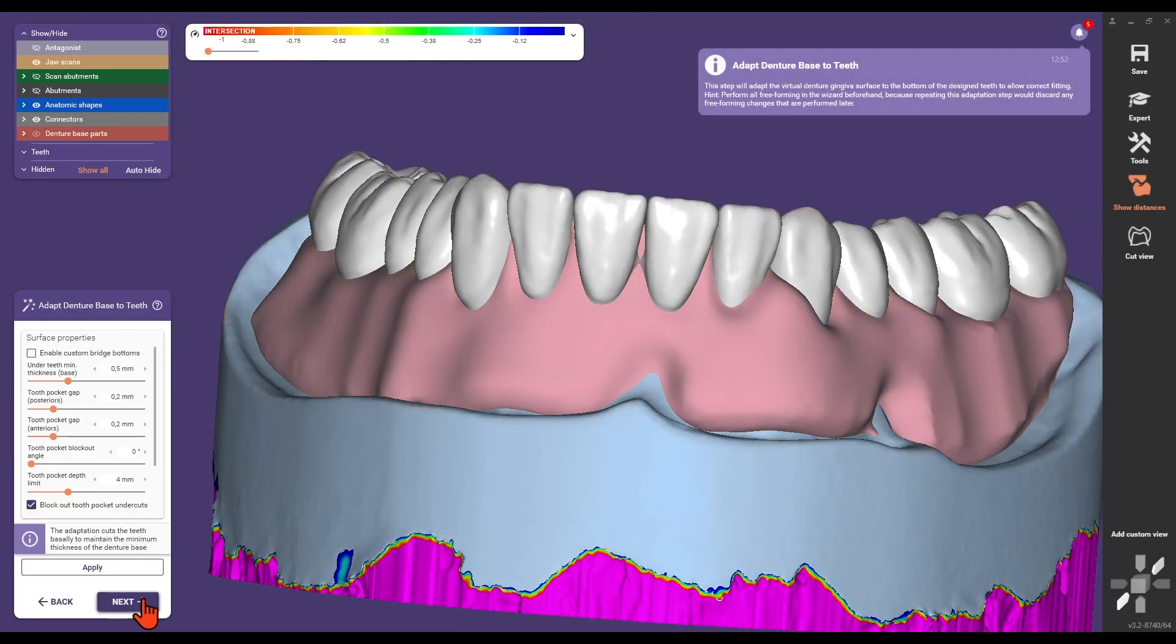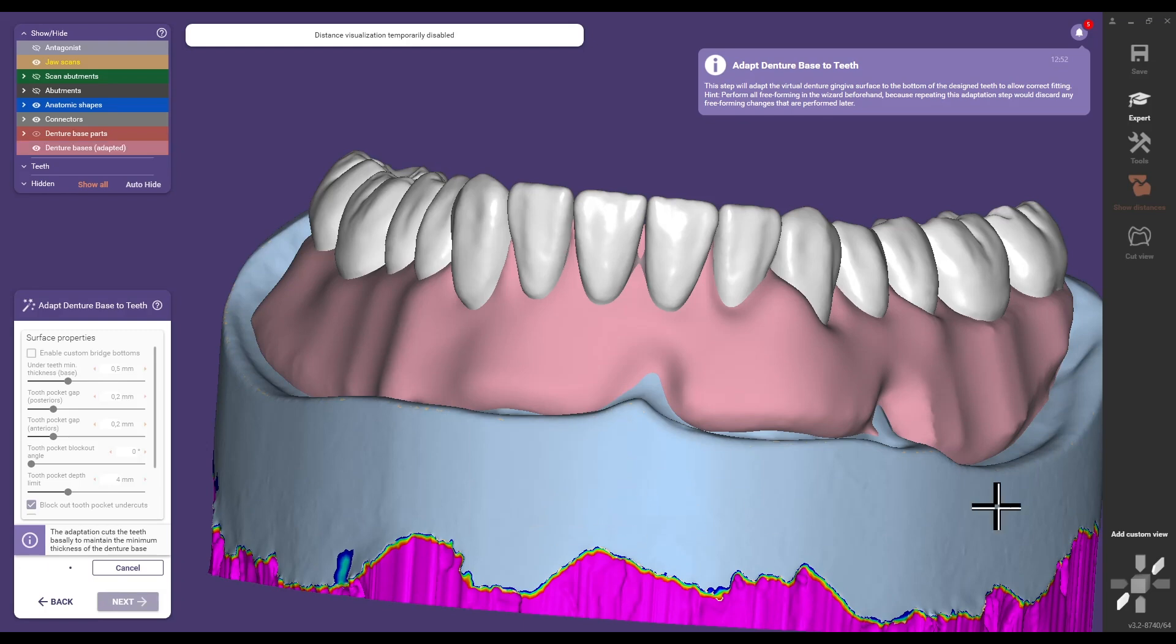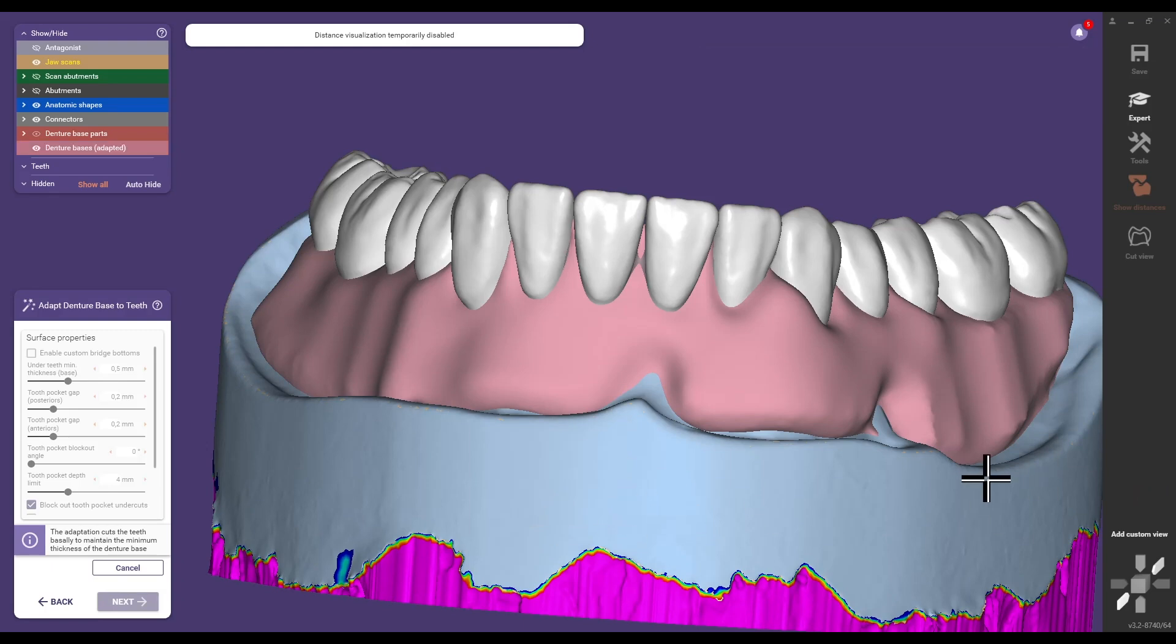After merging the Gingiva base with the teeth, check the basal blockouts or adhesive gaps for the NovaLock and MedentiaLock matrices.